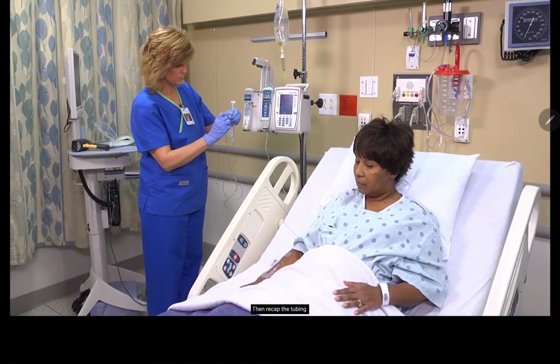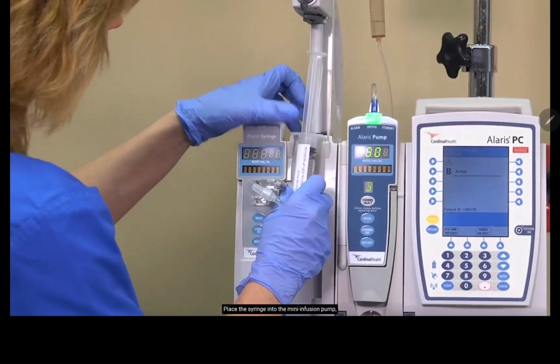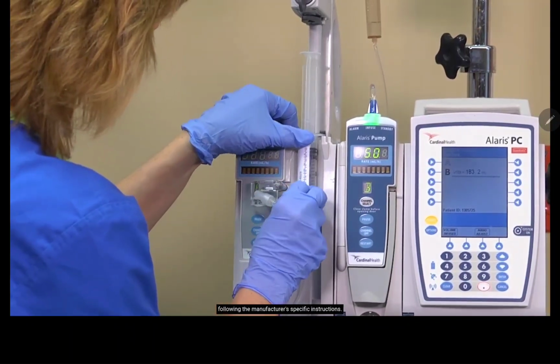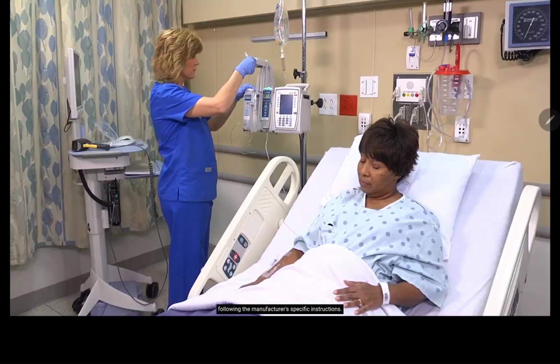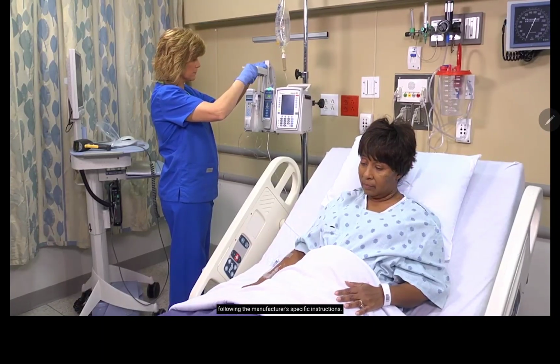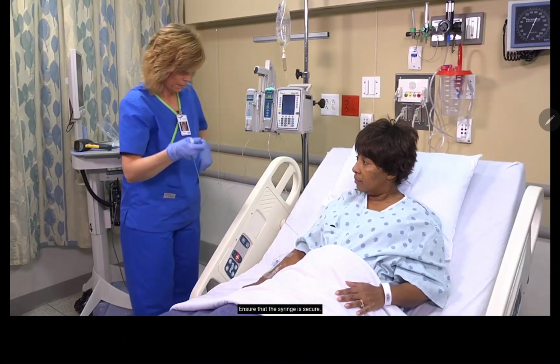Then recap the tubing. Place the syringe into the mini infusion pump, following the manufacturer's specific instructions. Ensure that the syringe is secure.